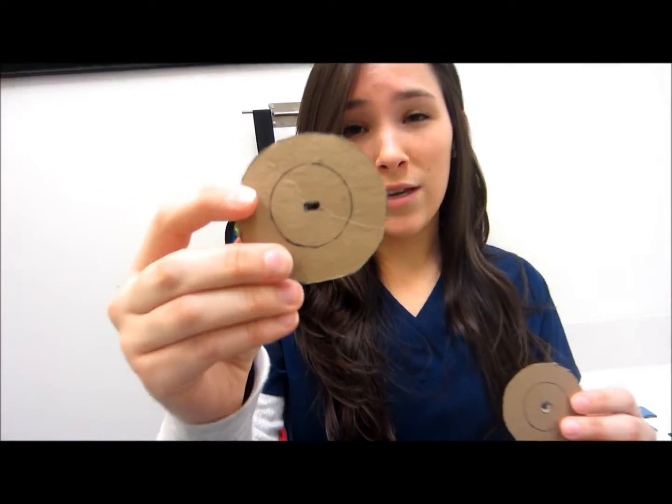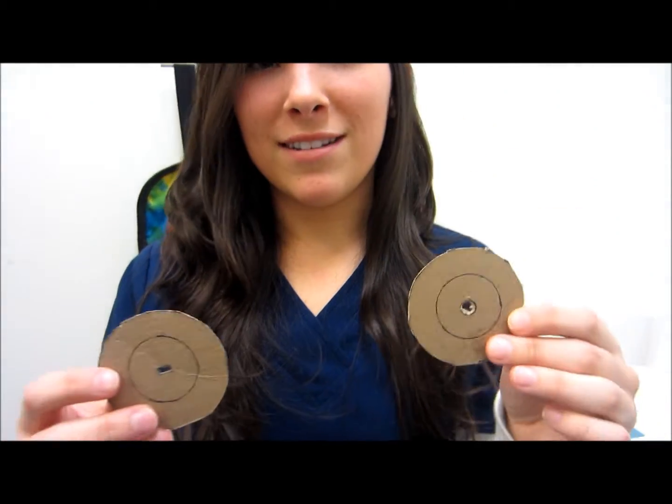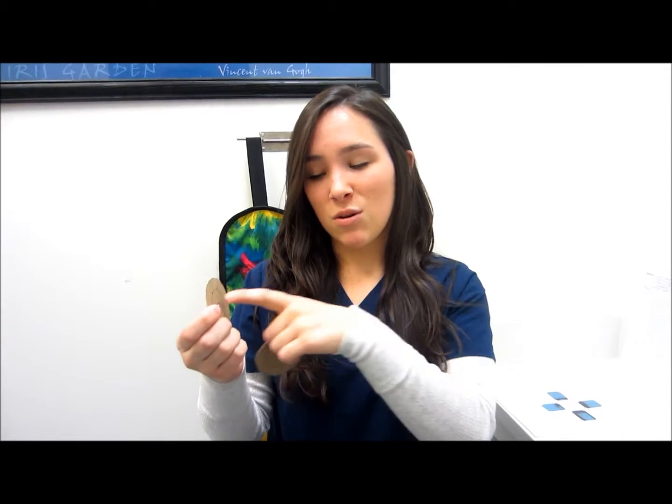What we're going to be using to demonstrate the different kinds of collimators. We cut out a rectangular collimator here, and then a round one here. We're going to show how the flashlight light goes through those.